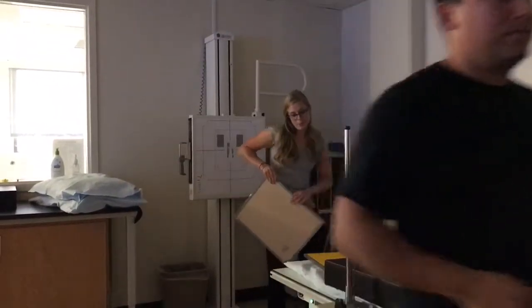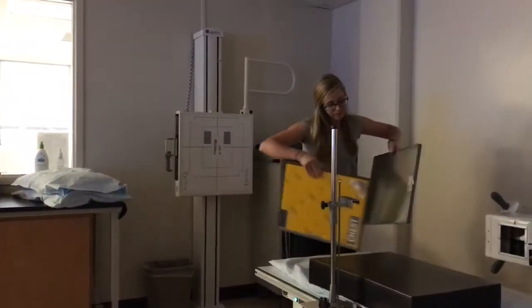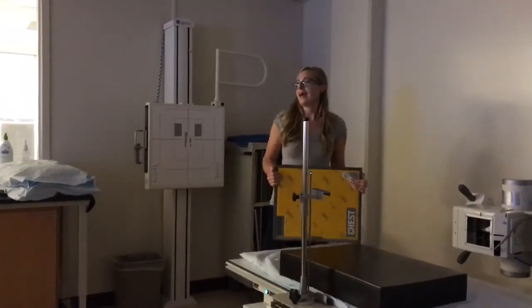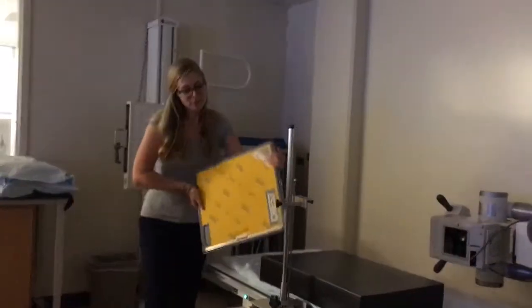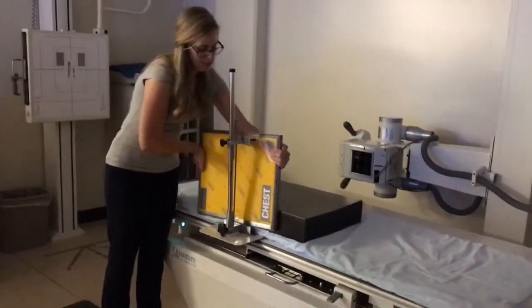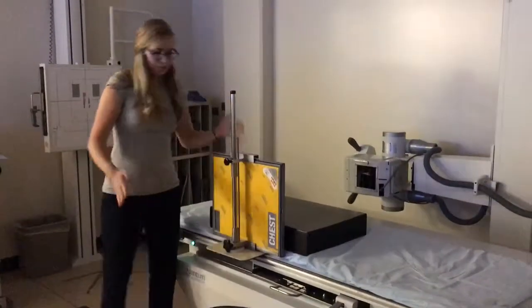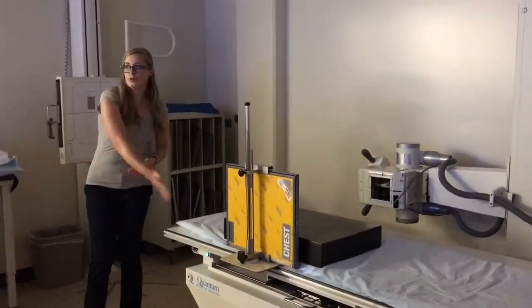This is a grid — it's called a grid cap. Because you put it on the film like a cap, and you put this in here and it holds it for you. Hence the term grid holder.